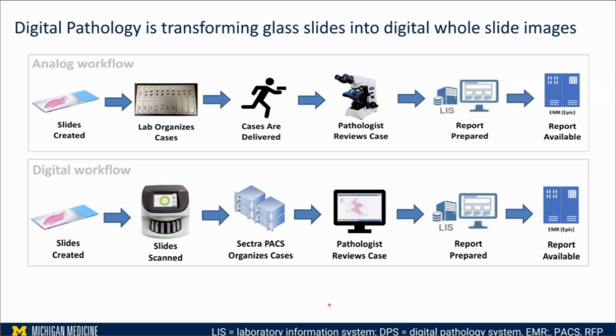The digitalization idea is to have special devices, the scanners, to digitize all those slides. You need a system to organize those digital images, instead of having personnel organize them and distribute them to the right people. Reviewing is also done in a digital workflow, and the way of reporting is the same, through the laboratory information system as well as the EMR.